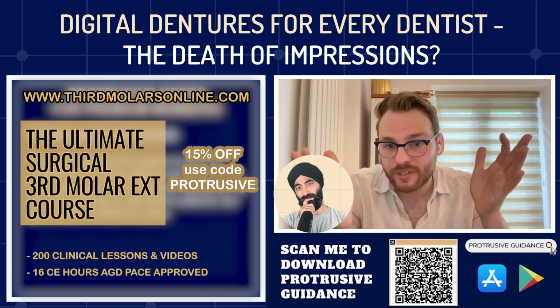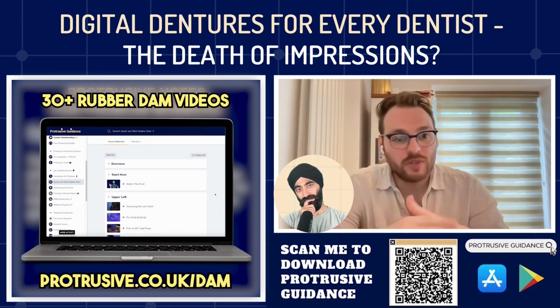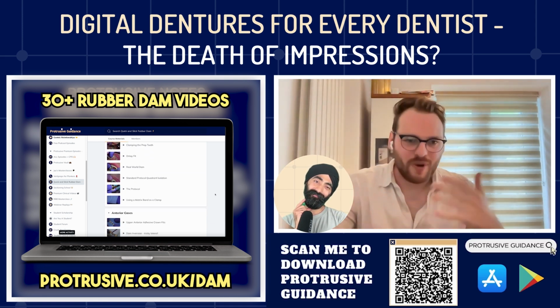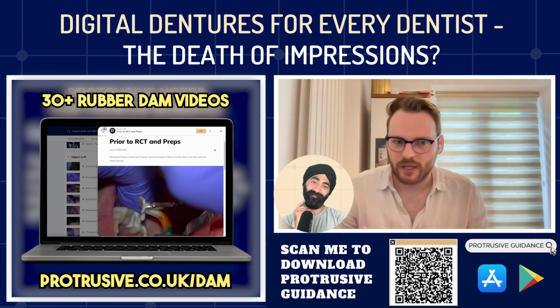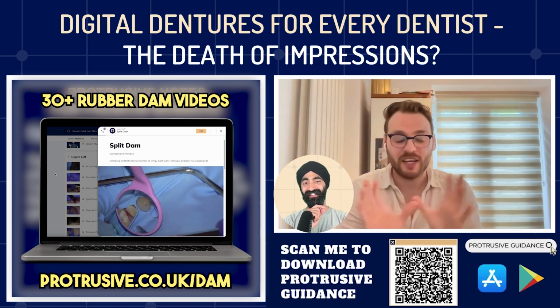Yeah, and that's the big thing. I've never done it before, so take away the printed try-in. Because it's always been like, yeah, it's great, awesome, go for it. But for this case, we did. And it's the old thing where they go, oh, can I take the wax try-in home to show my husband or my wife or my daughter? And you go, well, okay, but don't have a cup of tea and don't wear it for too long because it will start to melt and then the teeth are going to move and we've got to start again. Whereas this is rock solid.